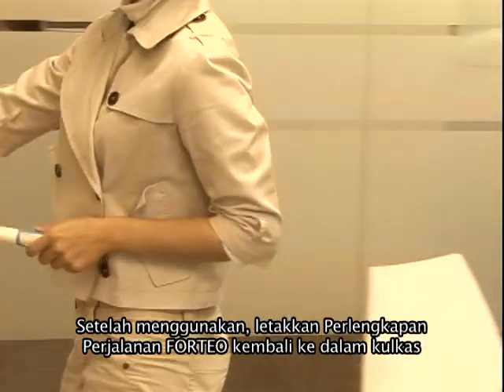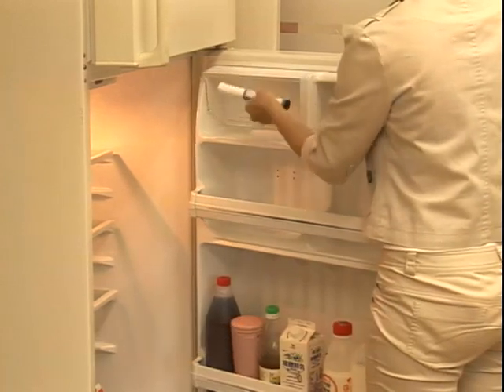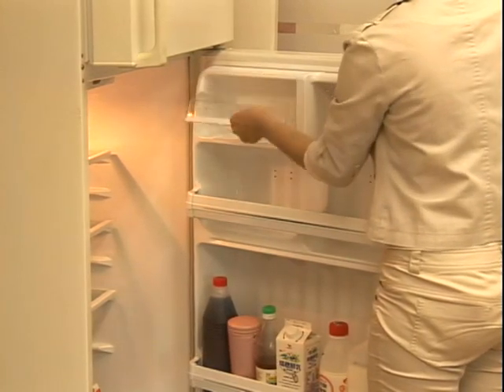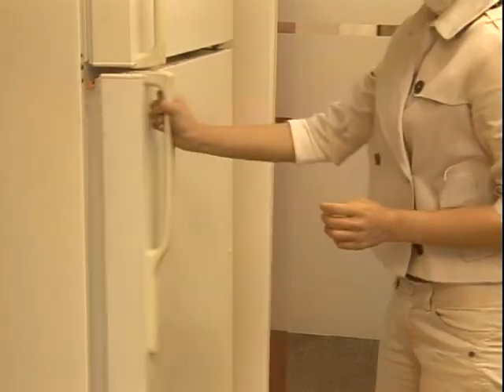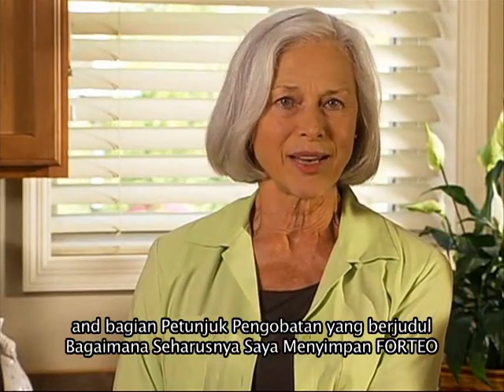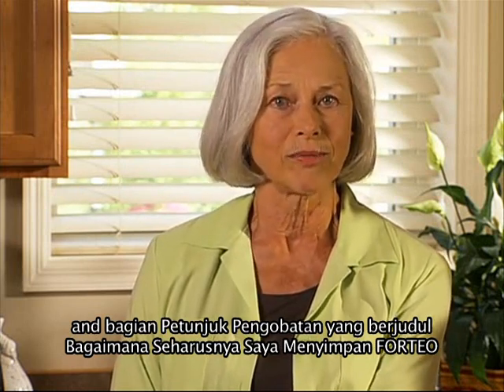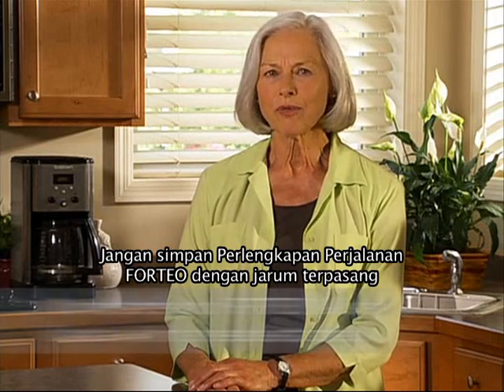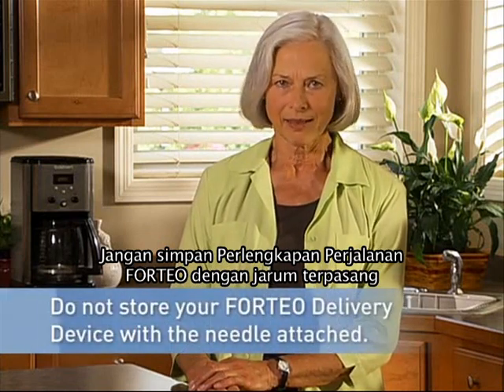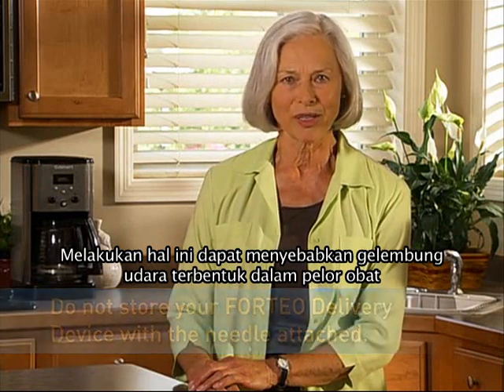Right after use, put the delivery device back into the refrigerator. Read and follow the instructions in the user manual and the medication guide section entitled, How Should I Store Forteo? Do not store the Forteo delivery device with a needle attached. Doing this may cause air bubbles to form in the medicine cartridge.